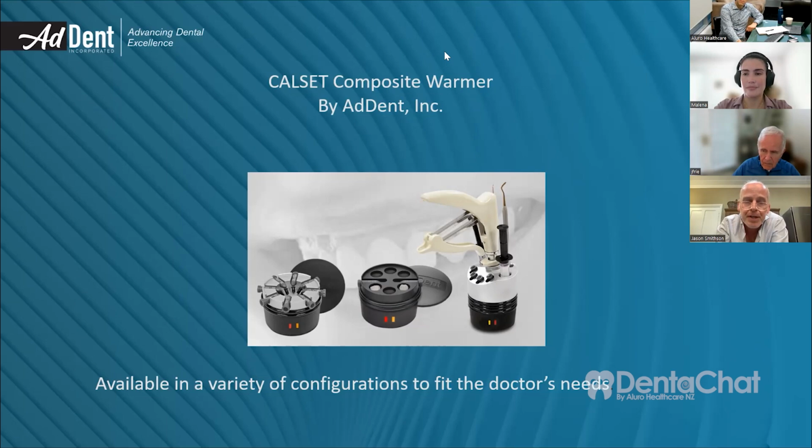I also do a lot of onlays, and I've been doing posterior onlays with lithium disilicate for 20 years or so now. I find the best outcome with onlays in terms of cementation is with heated composite.